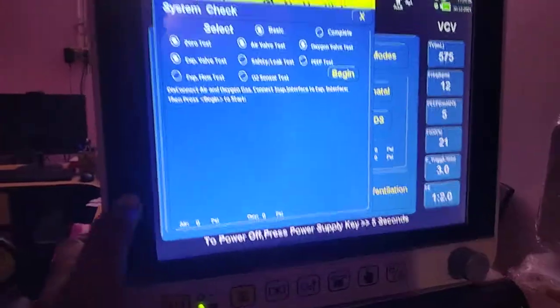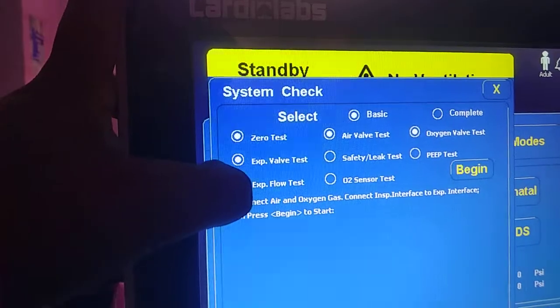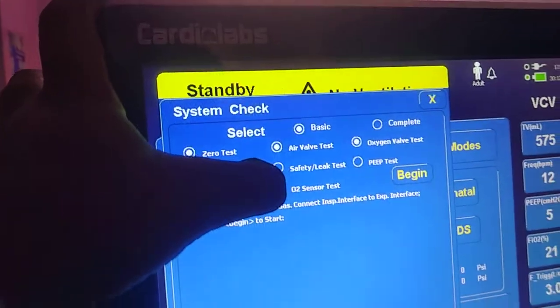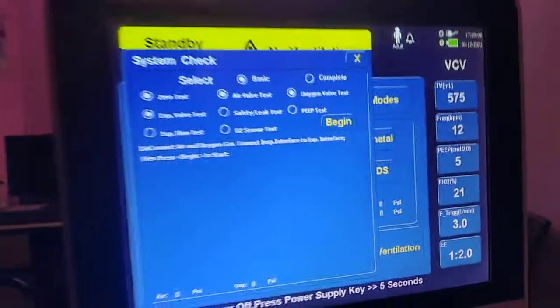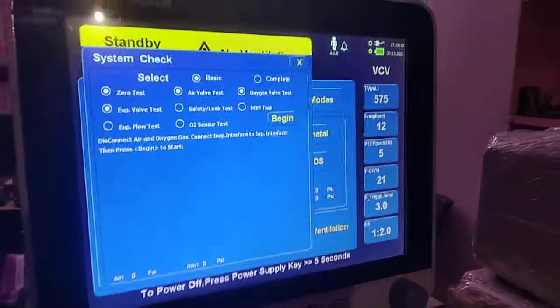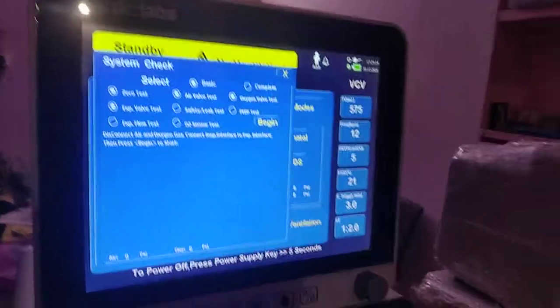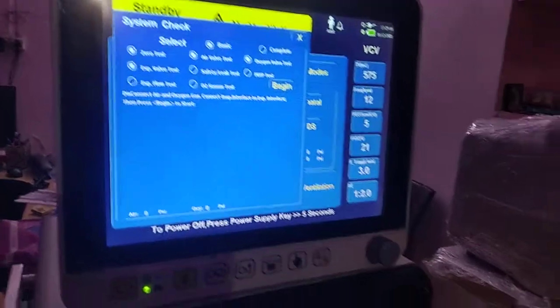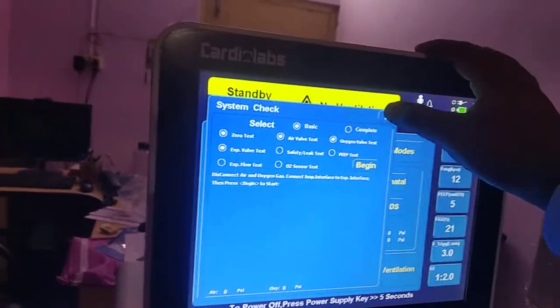From this standby window you can also perform a pre-test. In the pre-test you can check: zero test, expiratory valve test, expiratory flow test, air valve test, safety leak test, and O2 sensor test. We recommend performing this test before connecting to any patient to ensure proper and accurate delivery of gases. We will discuss how to do this test in a later video.